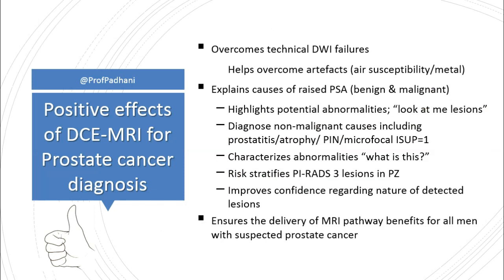So here are my conclusions. There are positive benefits of using contrast medium when trying to diagnose prostate cancer using MRI. It can help overcome DWI technical failures. It can help us explain the cause of a raised PSA, both benign as well as malignant.